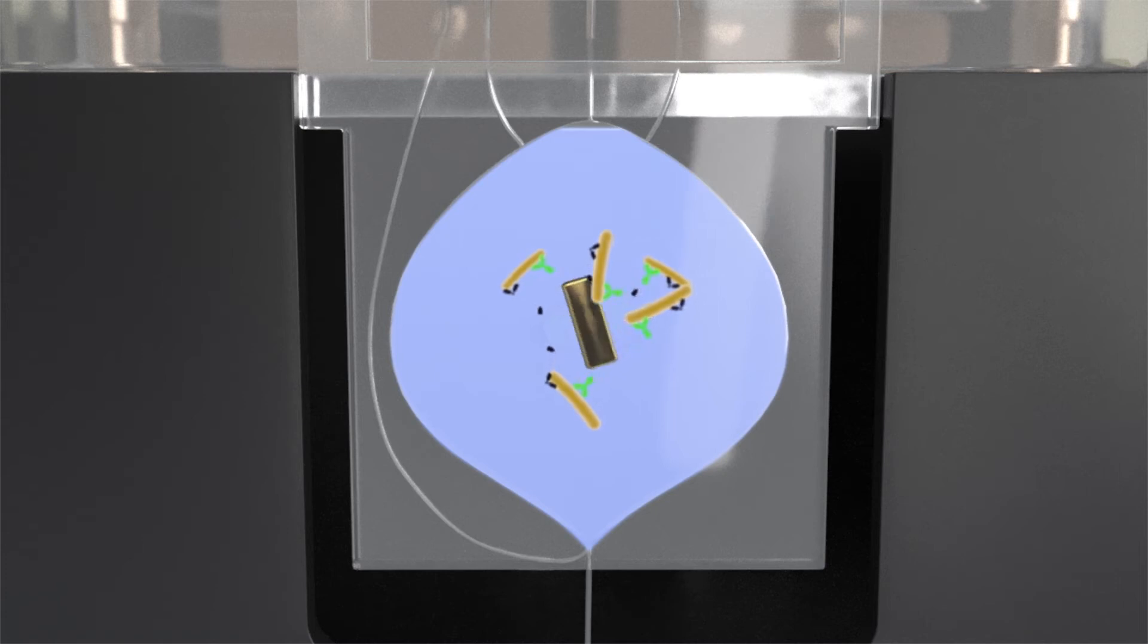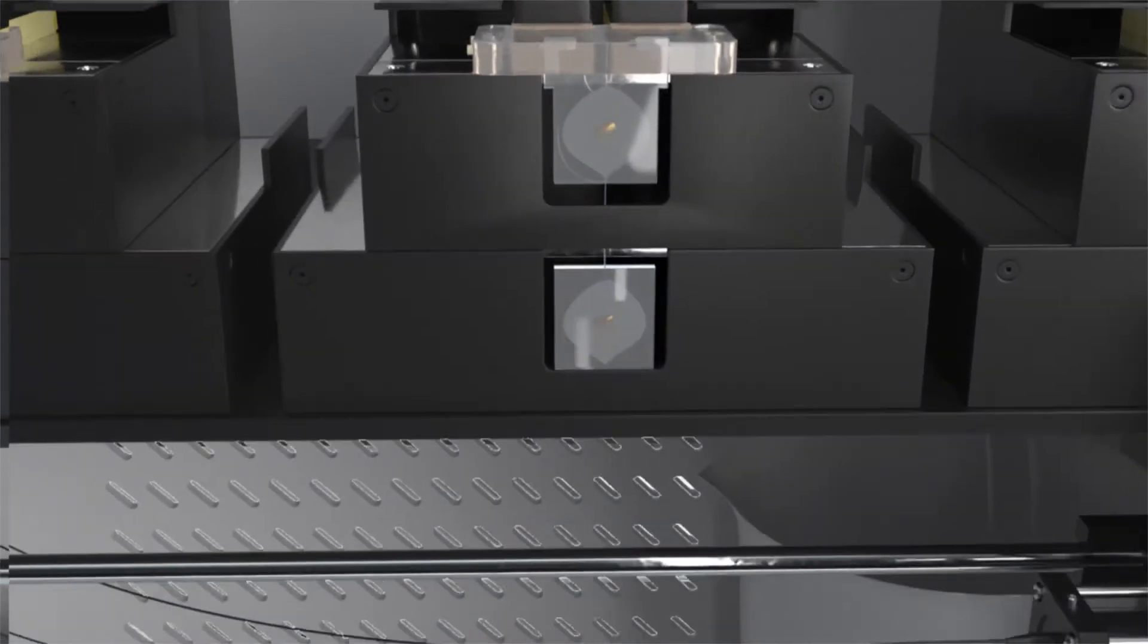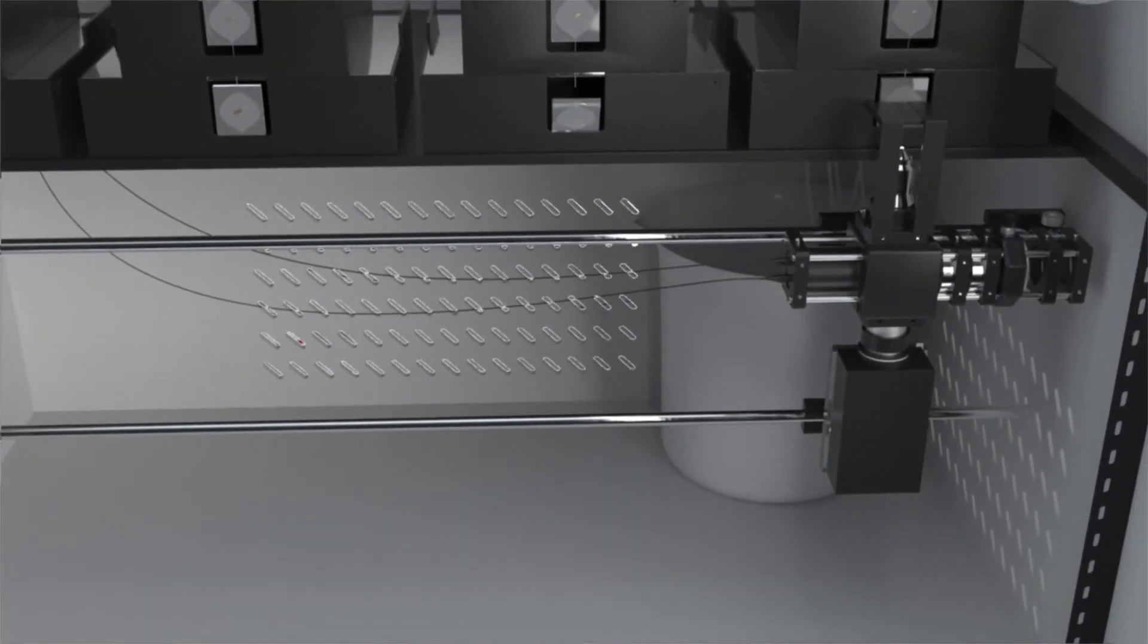After the supernatant extraction, an elution buffer and a release buffer are added and the sample is mixed again. During this process, microorganisms are detached from the magnetic antibodies. Finally, the processed sample is transferred to the reading cartridge.